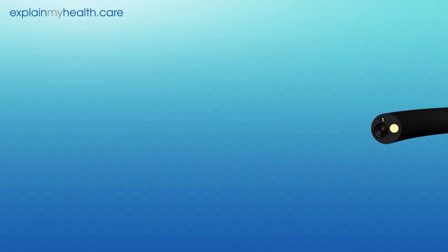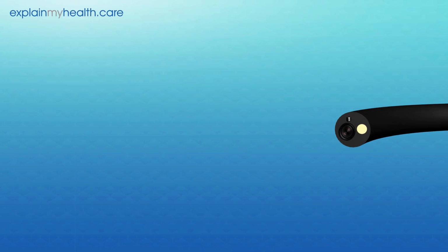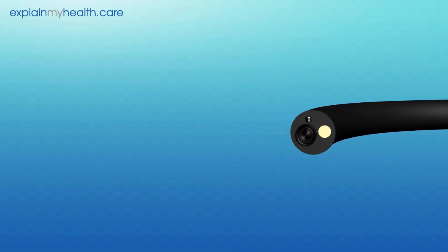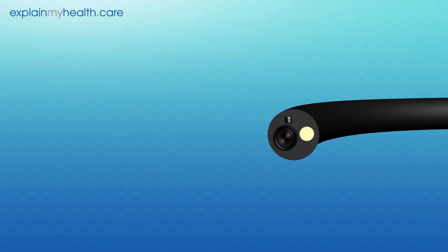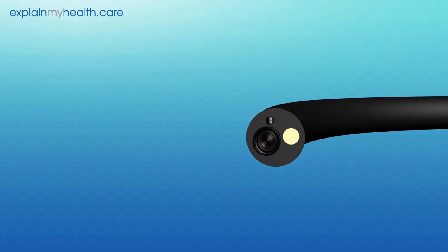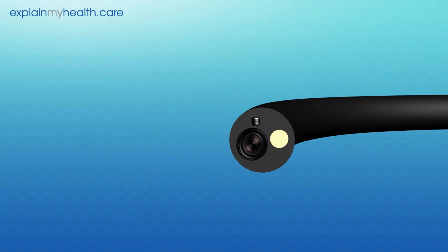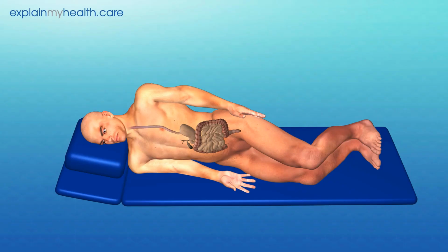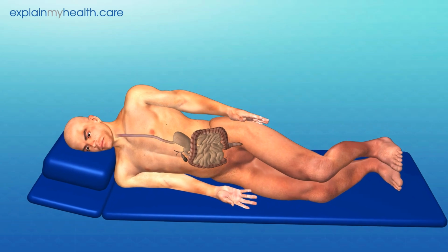The procedure is done using a tool called a flexible sigmoidoscope, which is a long, thin, flexible tube with a camera, a light, and a channel to insert instruments. This test helps find problems such as ulcers, infection, or abnormal growths. It usually takes 10 minutes, but can vary depending on your personal requirements. You can usually have this procedure without the need for medication or sedation.